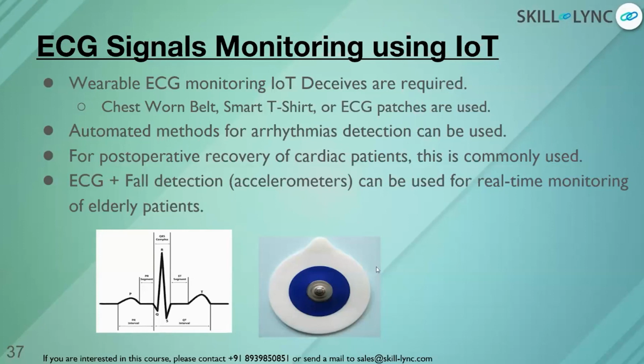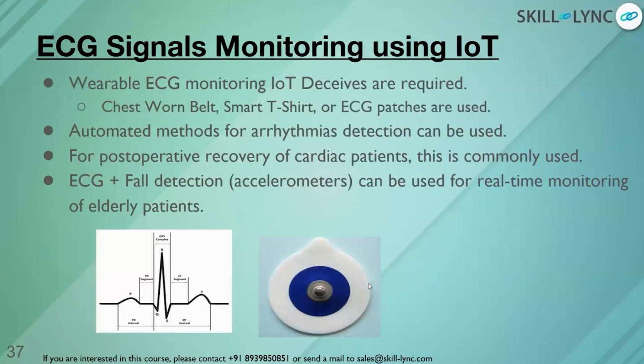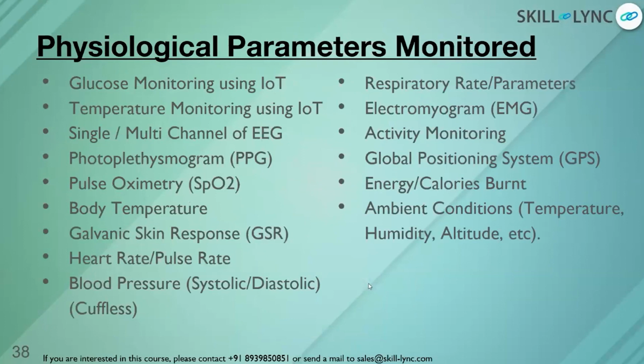Correct. So because these wearable devices are used for a longer time, we cannot use these kinds of electrodes. Now you have to come up with dry electrodes which will be used for a longer time, which will be very small in size, which do not need any replacement, which can stick for a longer time, which does not cause irritation to the patient. All these parameters have to be taken into consideration. Okay, so considering all these parameters, we have certain devices as well, to be honest.